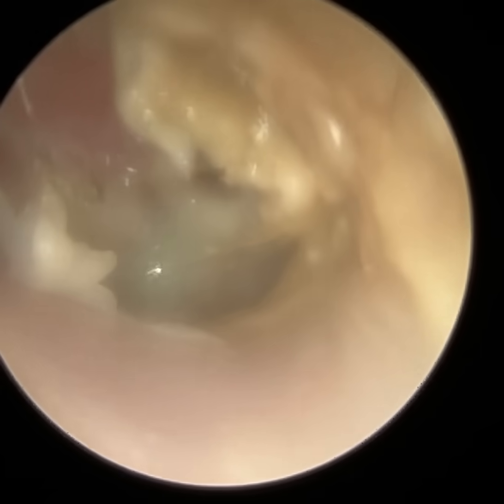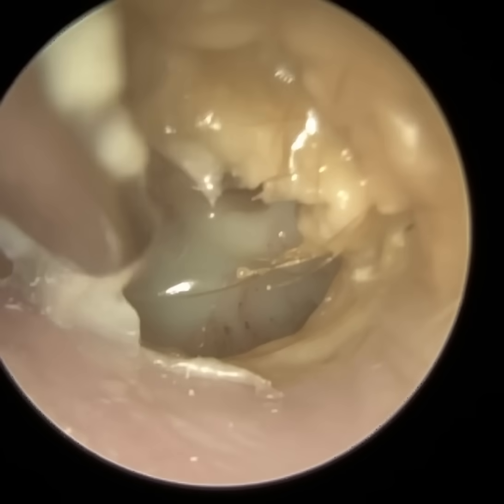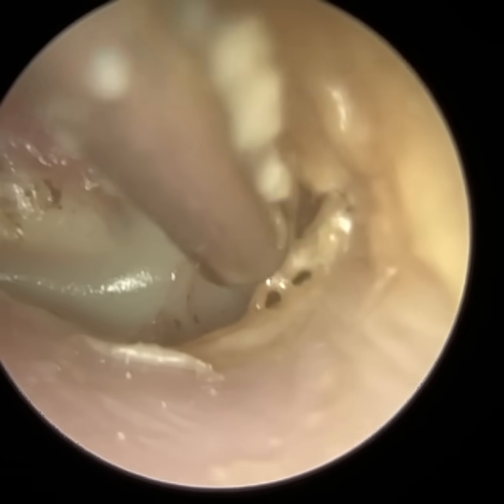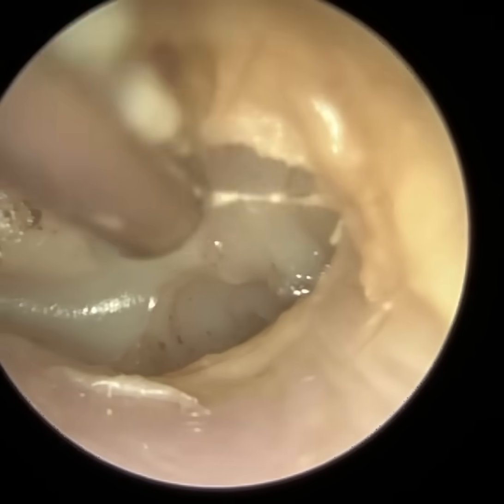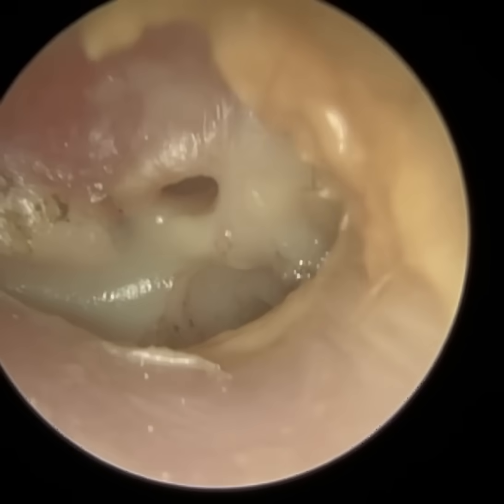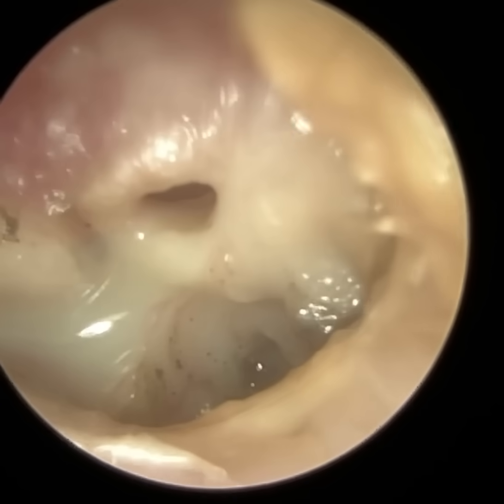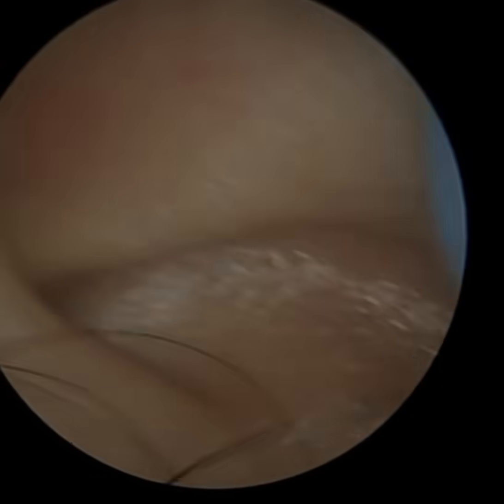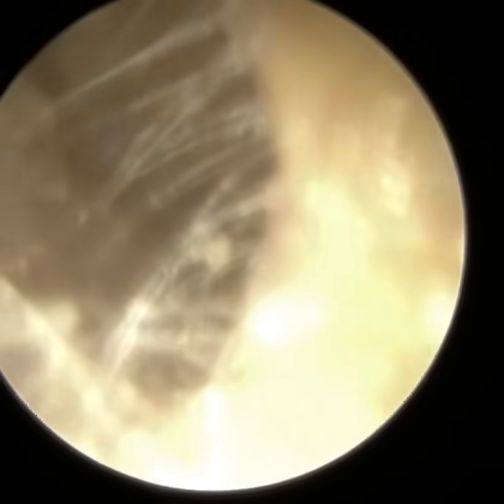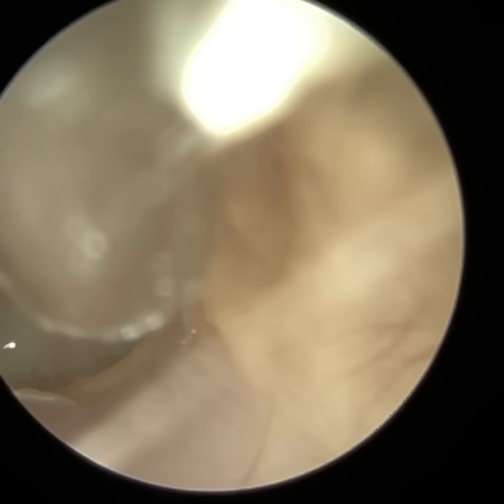So when you've got a perforation, there's many different reasons, and it may have been a middle ear infection, so there was catarrh, discharge in the middle ear, which filled up, and eventually when the middle ear is filled with fluid, infection, eventually it can no longer contain all that infection or discharge in the middle ear, so it ruptures through the eardrum. But the area around the perforation seemed quite dry actually, so I suspect this is more likely due to a secondary perforation as a result of otomycosis, so an outer ear infection due to fungus.